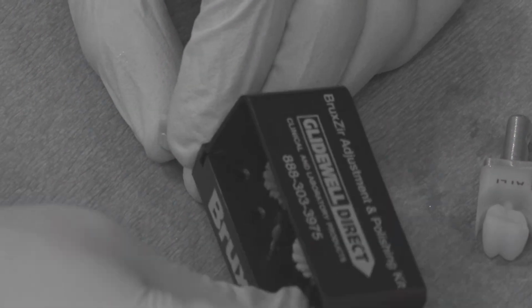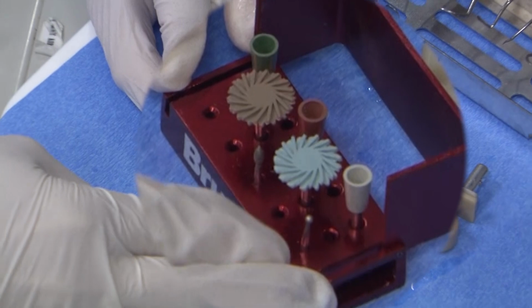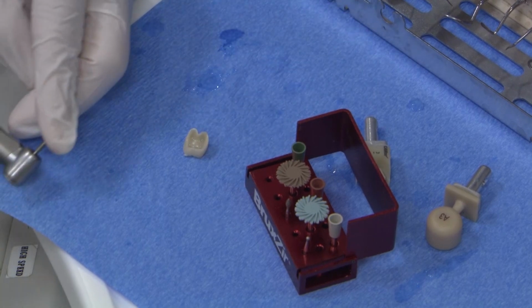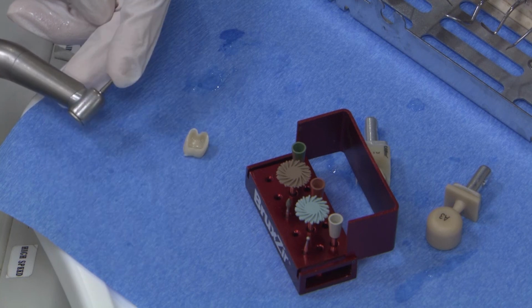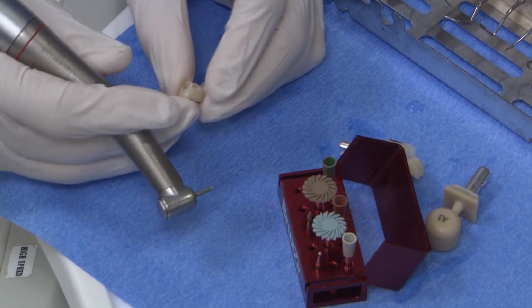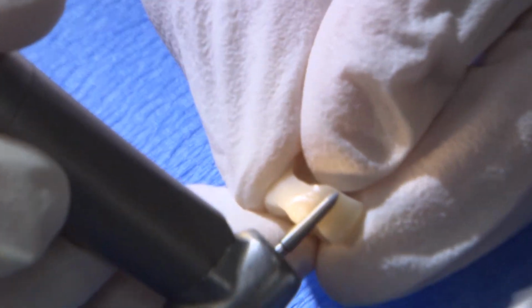And now this is the BruxZir adjustment kit. So this kit has diamonds on the front row and polishing wheels. I'll show you the polishing after. I went ahead and we're using a long tapered diamond to finish the sprue. But really, again, this is a diamond that's been formulated or designed for zirconia, but any fine grit diamond will work. So I'm just going to go after the sprue area.